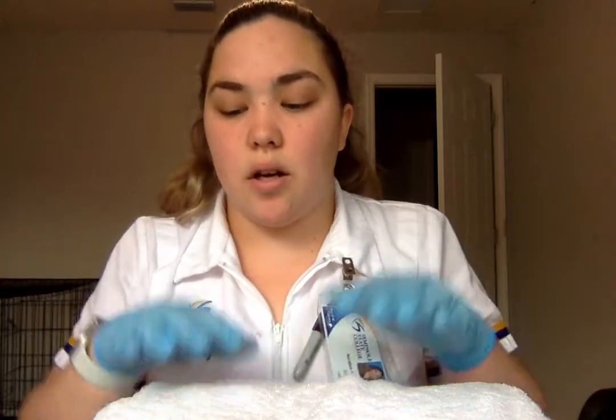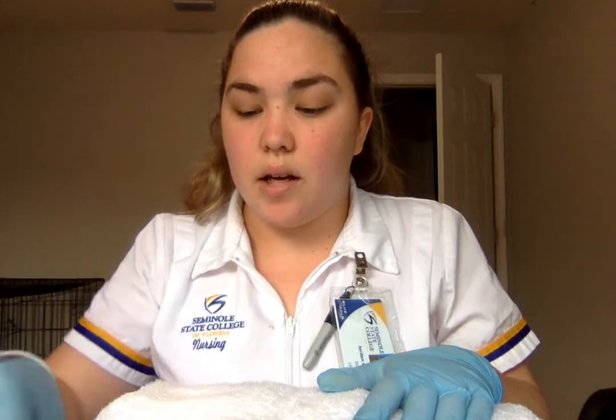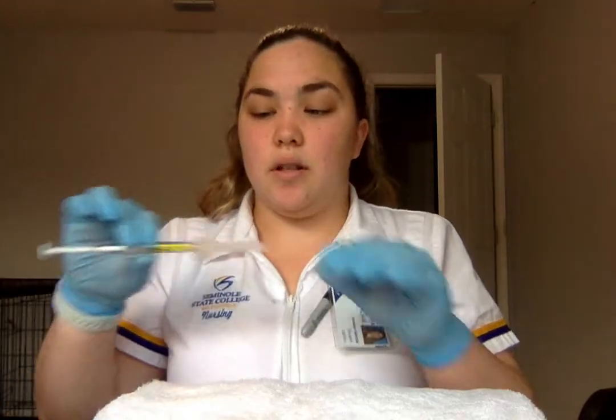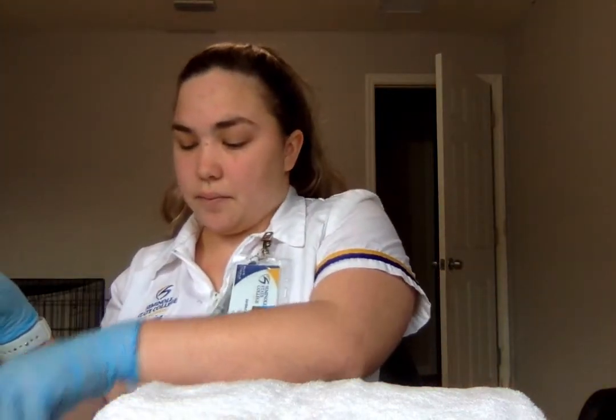Then I would lay her down. I would have her cover her lower half and expose her abdomen. Then again, I would clean the site in concentric circles, starting inwards and moving outwards. Then I would grab my vitamin B12. I'm going to set this to the side.